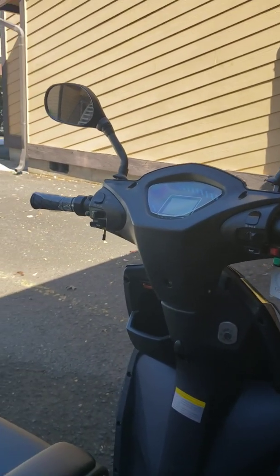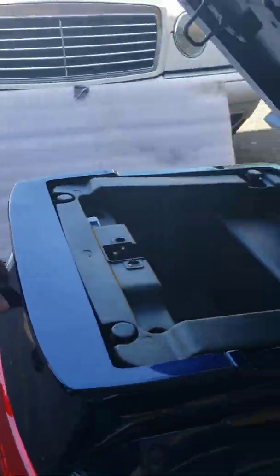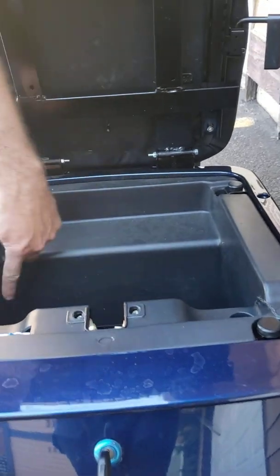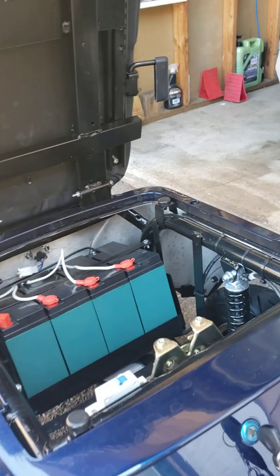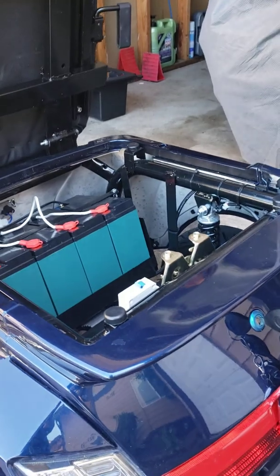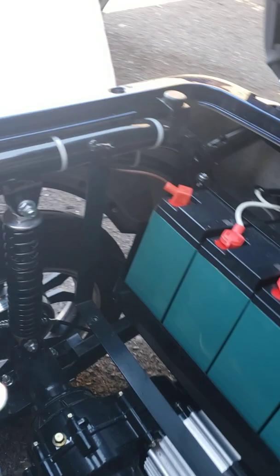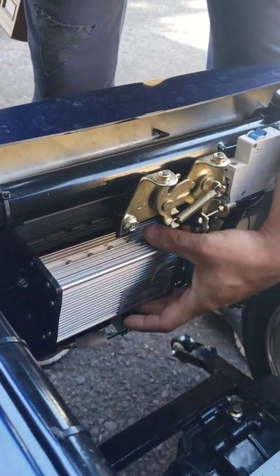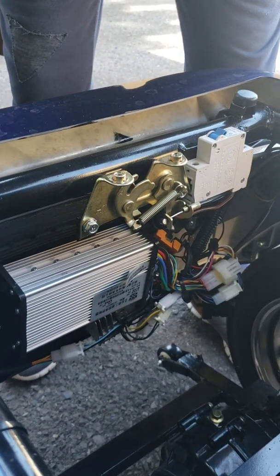You will have to open up the seat — remove those two screws right here and two on the bottom — to lift up the tray. Once you lift up that tray, you will see the main computer of the machine. This could be the problem, or your accelerator handle could be the problem.